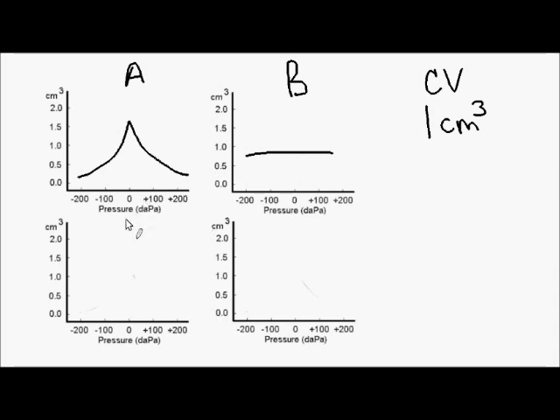A type C tympanogram looks like this. This suggests that there is negative pressure behind the drum in the middle ear space. This usually means the patient has some eustachian tube dysfunction, in which the ears cannot equalize pressure correctly. At rest, the eardrum is retracted into the middle ear space.